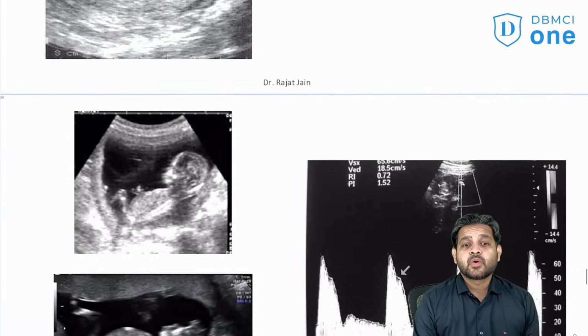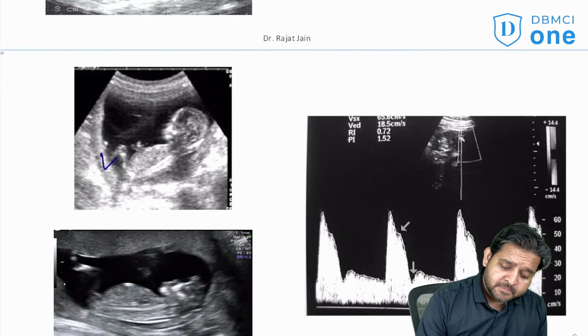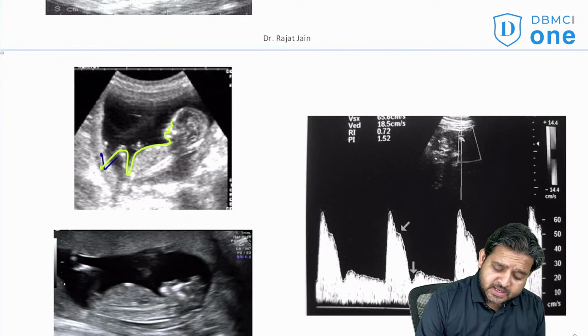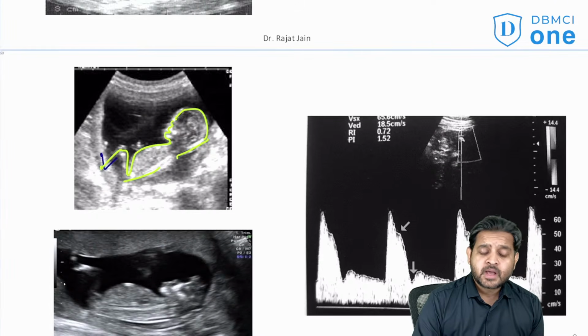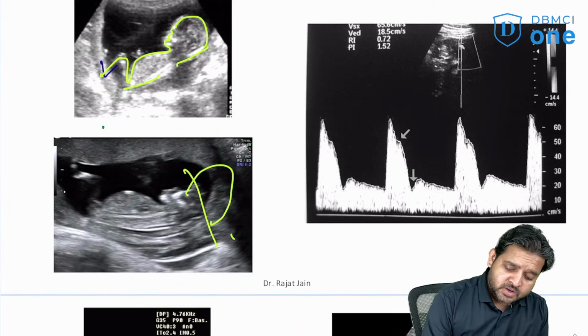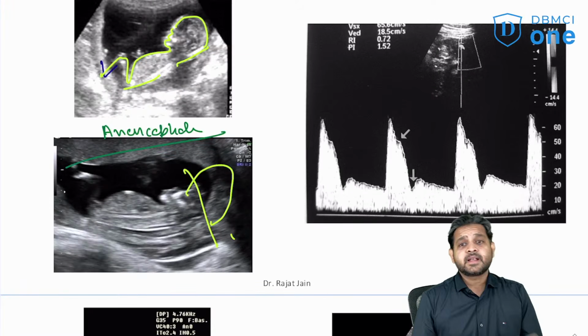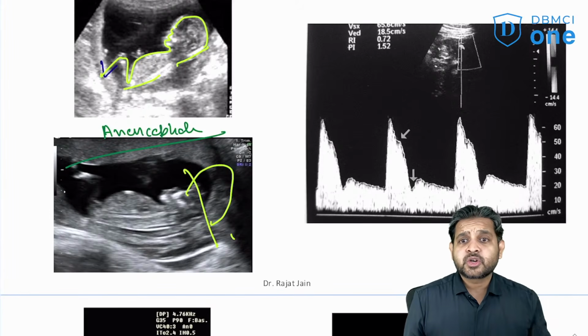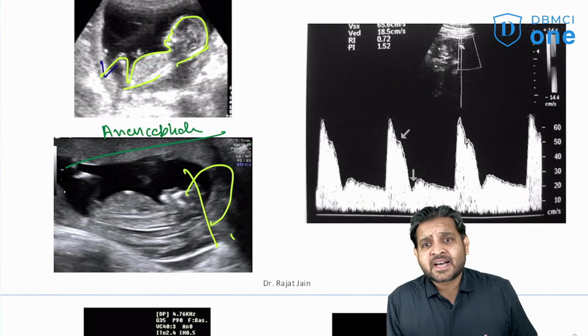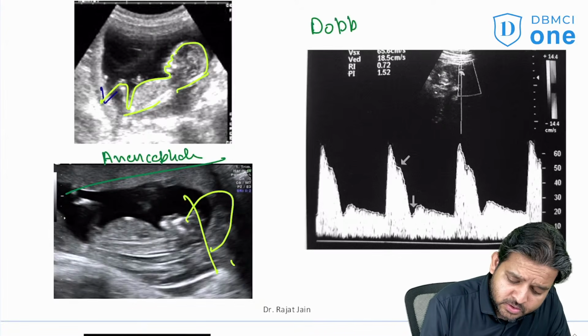Okay, now this is how a mid-size pregnancy looks like at around 12, 13, 14 weeks, when you can see the leg, abdomen, chest, skull, face and the vertebral column. And when the skull is unable to develop, what is this called? This is called anencephaly, right? Anencephaly.